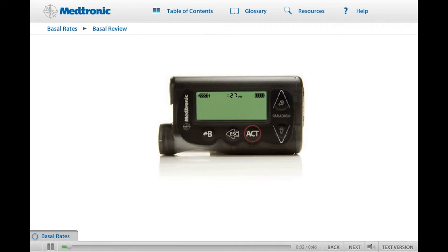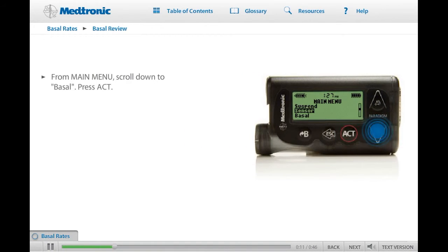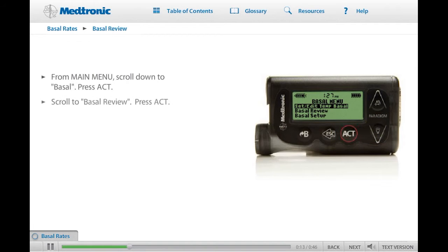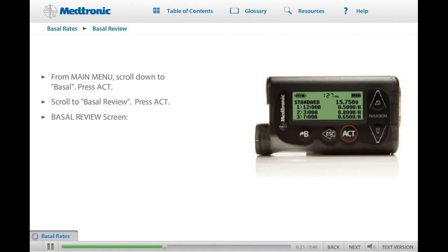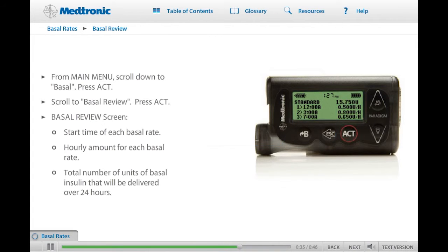Now that you have a few basal rates programmed, let's look at the basal review screen. To see the basal review screen, start at the main menu. Scroll to Basal and press ACT. On the basal menu, scroll to Basal Review and press ACT again. Your basal review screen displays the basal rates currently programmed into your pump, showing the start time of each basal rate, the hourly amount, and the total number of units of basal insulin that will be delivered over 24 hours. If you are using your pump to practice, try accessing your basal review screen now. Click Next when you're ready to continue.